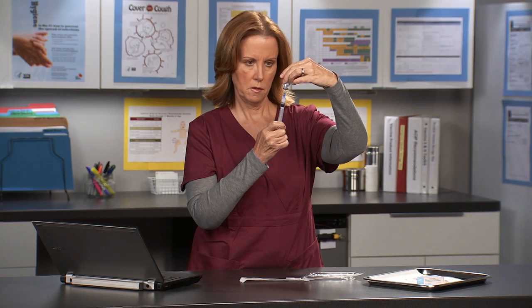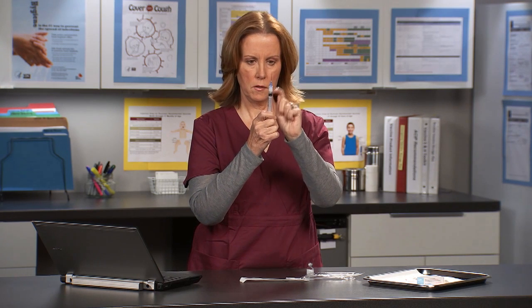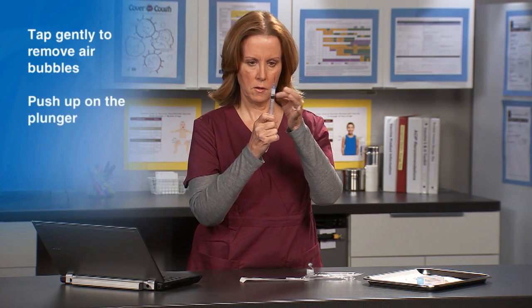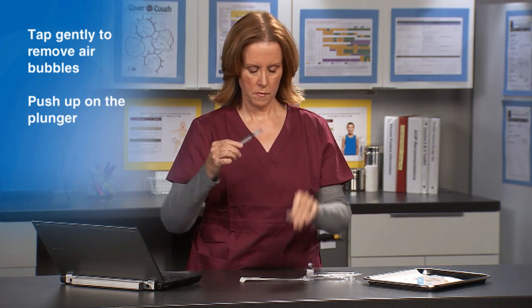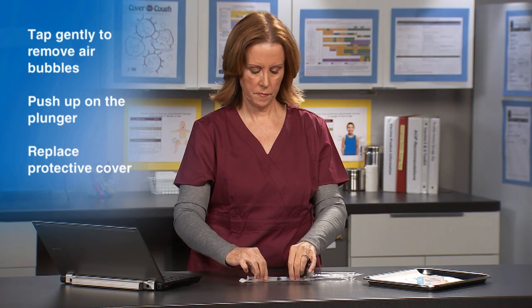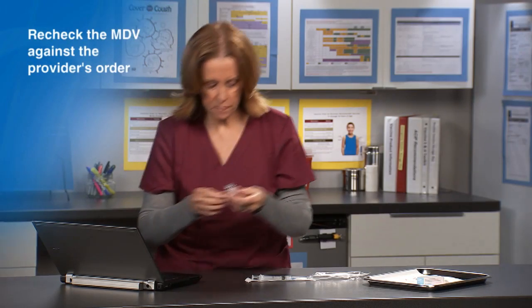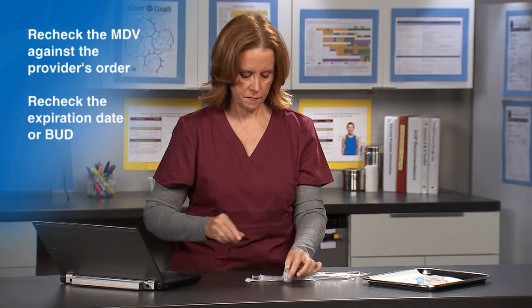Remove the vial from the needle and return the vial to the counter. To release any air bubbles, tap gently on the barrel of the syringe and then push up on the plunger, being careful not to expel the vaccine. Now recap the needle by replacing the protective cover. Recheck the multi-dose vial against the provider's order and recheck the expiration or beyond-use date if present.